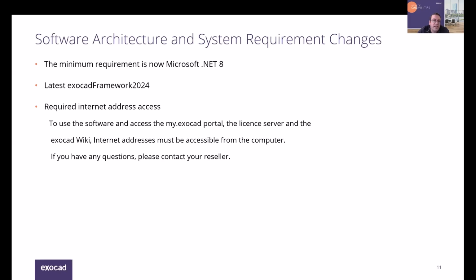And then required internet address access. There are a number of URLs, internet website addresses, that need to be accessible for a lot of the software functions to work. You can contact your reseller for more specifics about that if you have any questions on that topic.